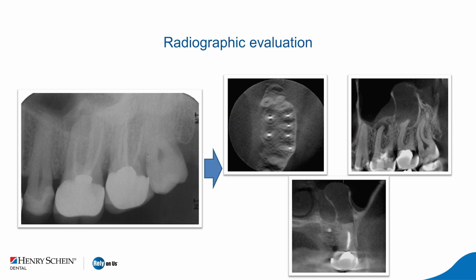There's no endodontic filling material that we can see within that MB2 canal. So that's probably why there is still remaining disease associated with those endodontically treated teeth. It's very difficult to assess on a PA, while it's obvious on the CBCT.